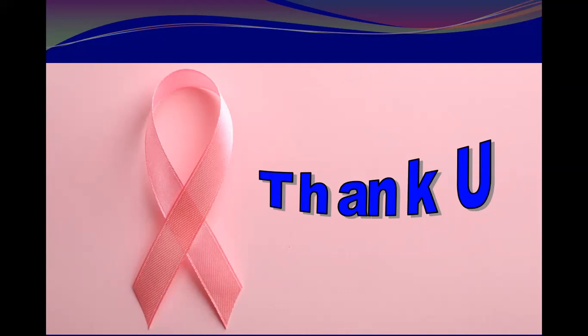It becomes palpable. Okay. The most important thing is that it is not 3-dimensional, meaning when I turn the probe 90 degrees, it has no shape. It is not a mass. It will not be 3-dimensional, because it is not a mass. But if you could see a parenchyma like this coming anterior and with this criteria, that means you are dealing with a parenchymal or a fibrous ridge. But in the region of the areola, again, think about Montgomery. Okay, think about Montgomery.